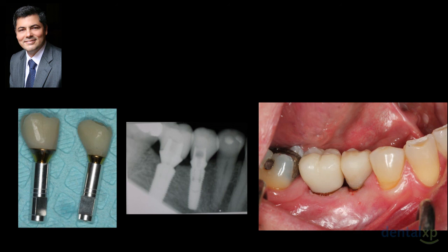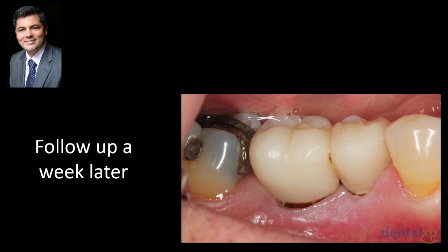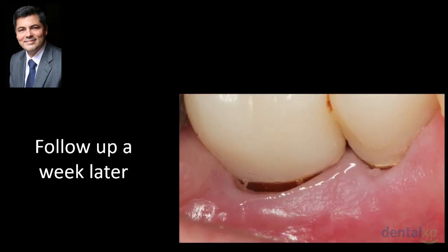And that's why the main message that I wanted to send you today was the possibility of implementing the quick model into your practice. The healing is fast. The healing is pretty much always good. It's a week later, but we know that these crowns are likely not going to be permanent crowns. These are fancy, temporary crowns. If we would have gone into the quick model and utilized the quick model, this finish line probably would have been somewhere around here. I would have probably chosen to utilize a different block and mill a ceramic material. But it makes the case for what I was explaining to you.